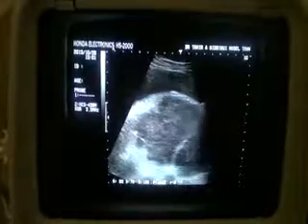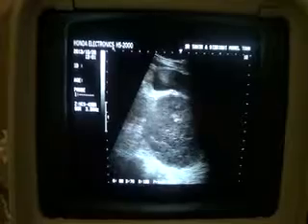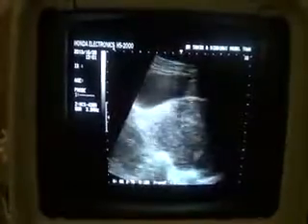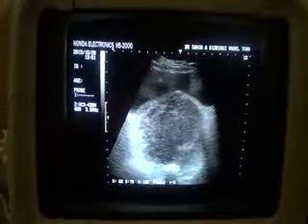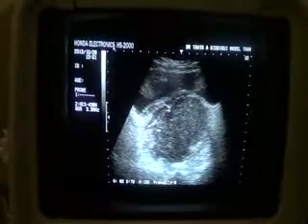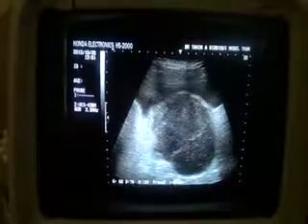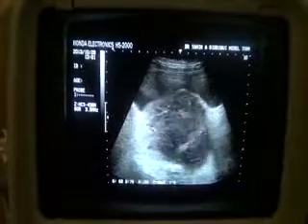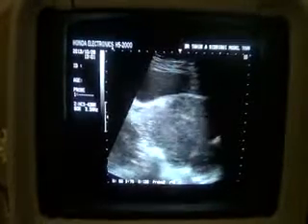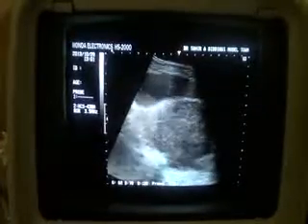Now when I give a full sweep to the cyst, it does not change its shape. See the posterior wall acoustic enhancement. So this is a cyst full of thick echoes with multiple scattered internal calcifications and a thick wall, and is consistent with either a hemorrhagic cyst or an abscess or a pyosalpinx on the left side.